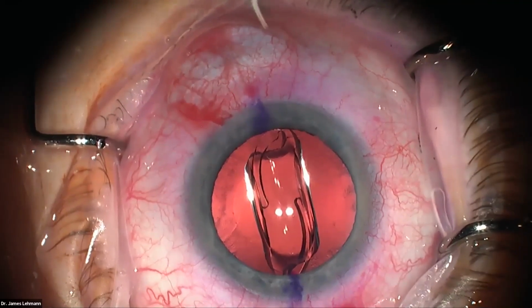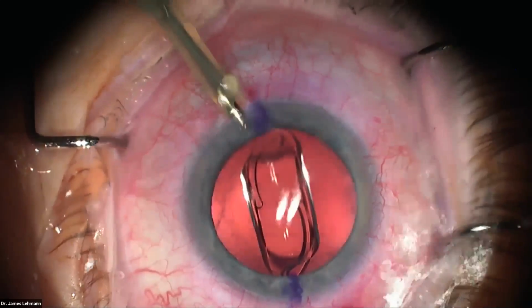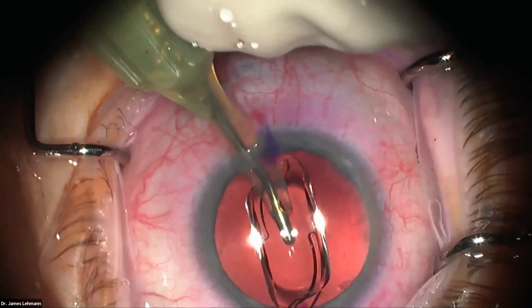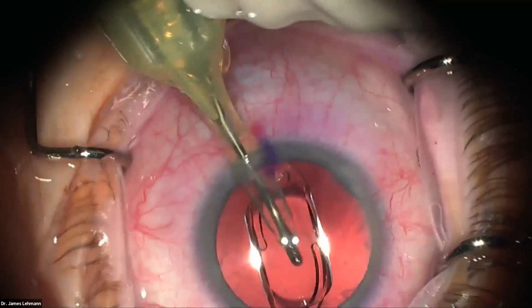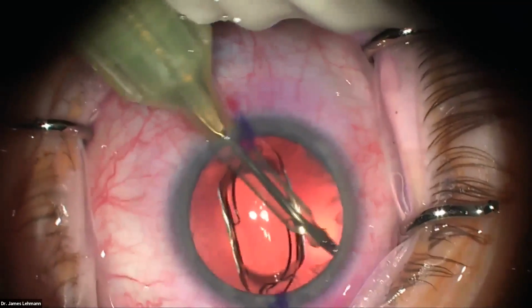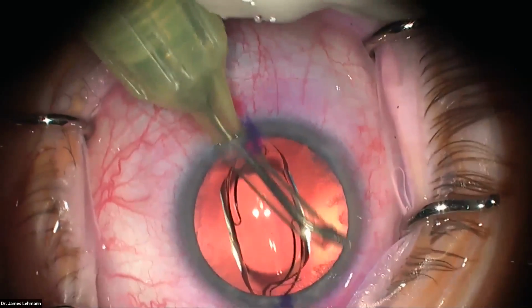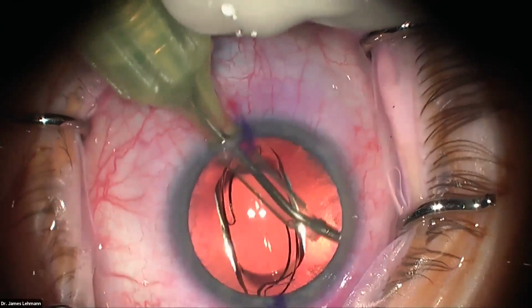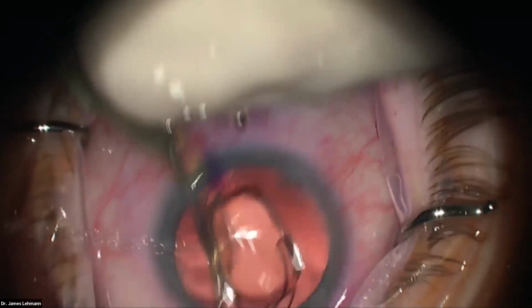This is the I/A handpiece with the viscoelastic setting, which just means a little more vacuum and a faster ramp up. So here I'm removing, you can see the little movement in the anterior chamber of all the viscoelastic. This is a case where you could easily have a nuclear fragment hidden because she has a light iris and a little bit of arcus. So I'm going around the angle and making sure there's no fragments hidden there.